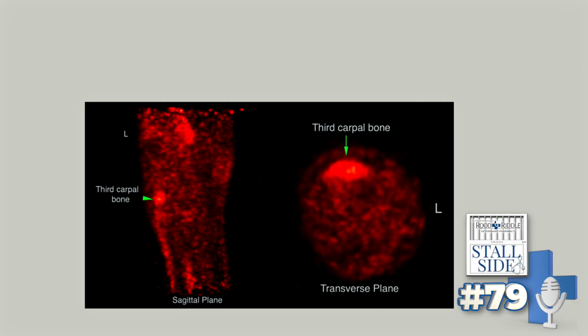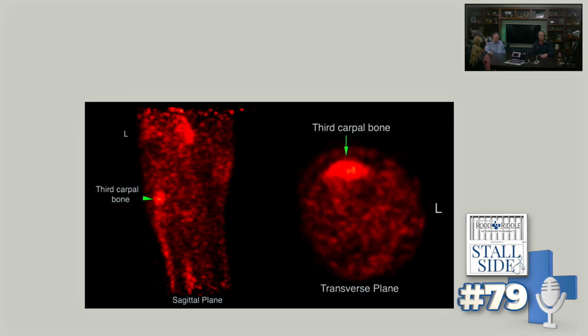Okay, great. So, do you have any images you could actually show us? And for those that are not watching, could you describe? Yes. So I have a couple that I brought along with me. The first is just the raw data that we get back from the PET scanner itself.